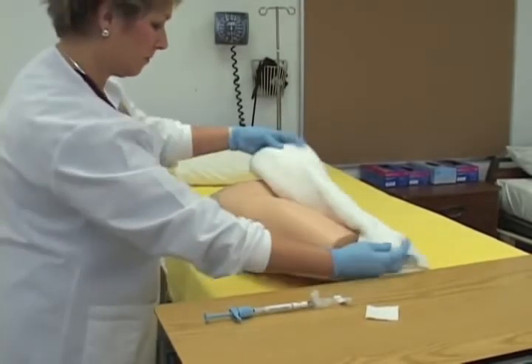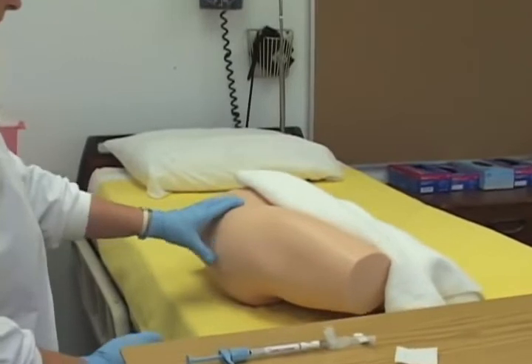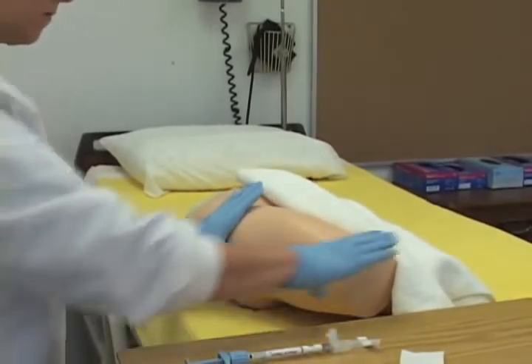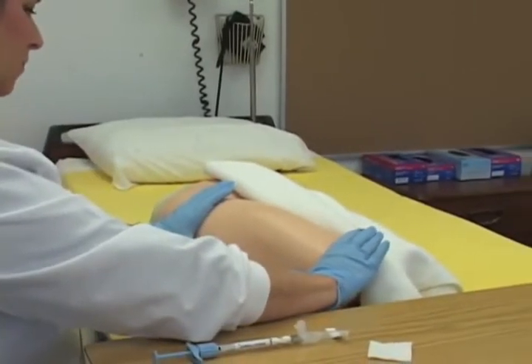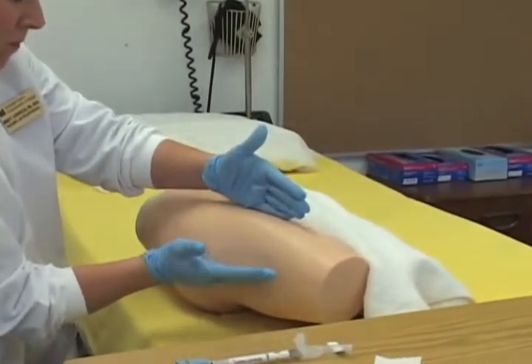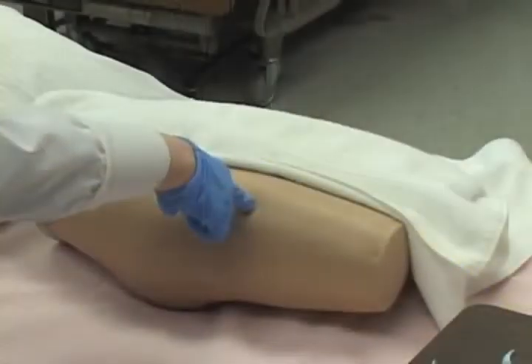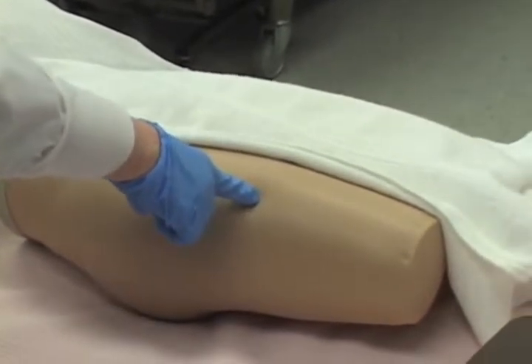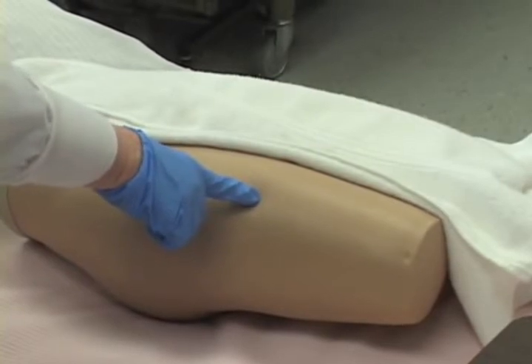We will be using the vastus lateralis. You first will locate the greater trochanter. Put your palm on the greater trochanter and locate the patella. Put your palm on the patella. And then you need the anterolateral aspect, which means not the side of the thigh, not the top of the thigh, but in between. So your injection site would be right here. You need to assess the site of choice and assure the area is non-tender and free of lumps, nodules, scars, or bruising. Do not use an extremity with potential for lymphedema.